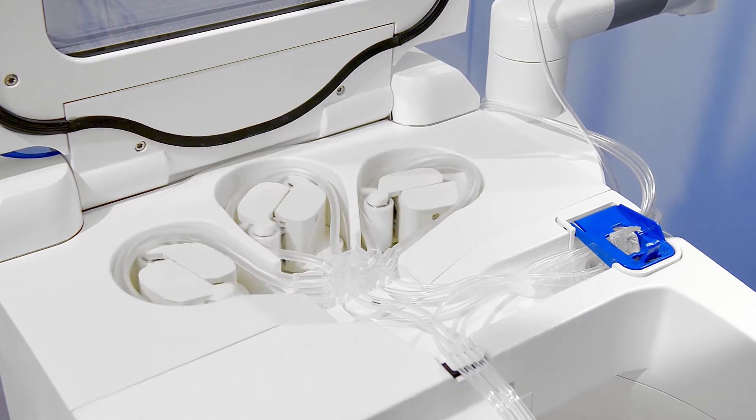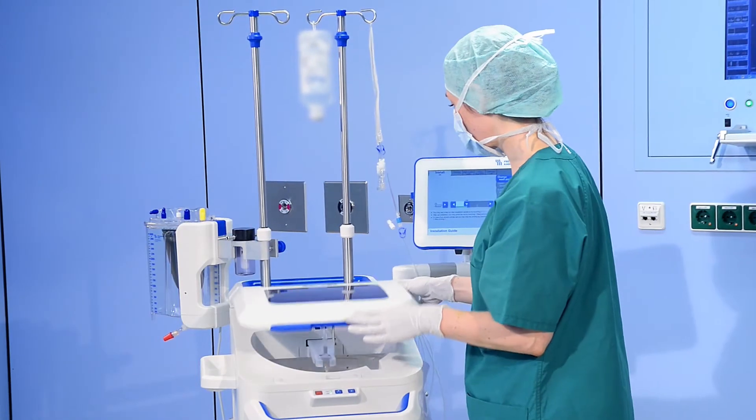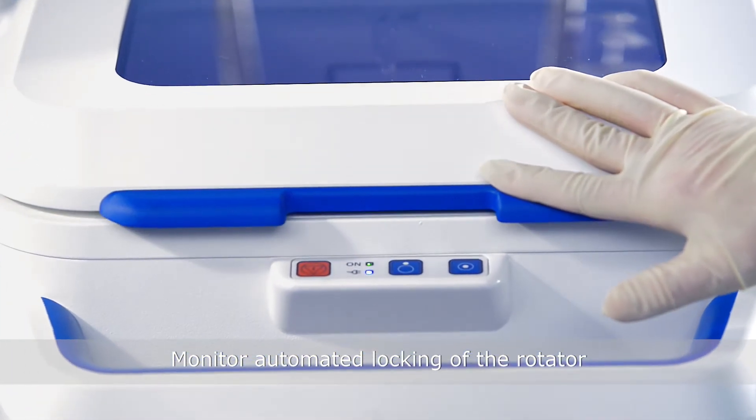Press the Load Pumps key and monitor the loading procedure. Close the centrifuge lid and be certain to hear a click.